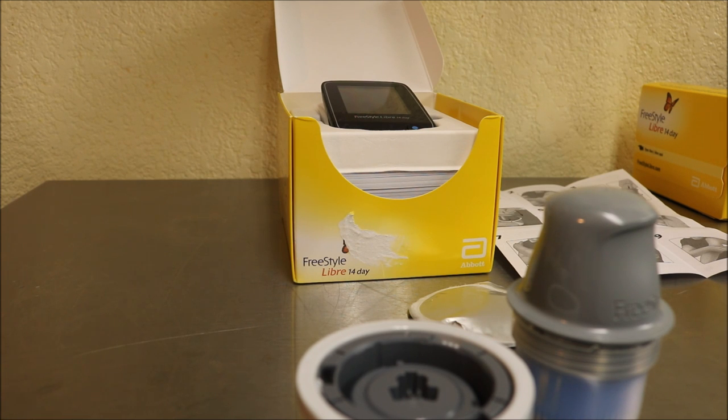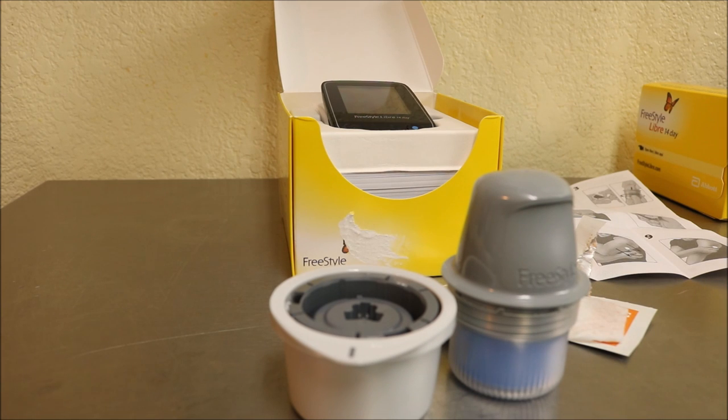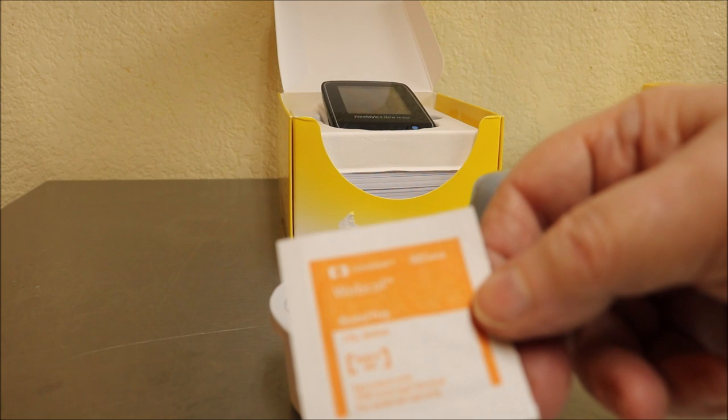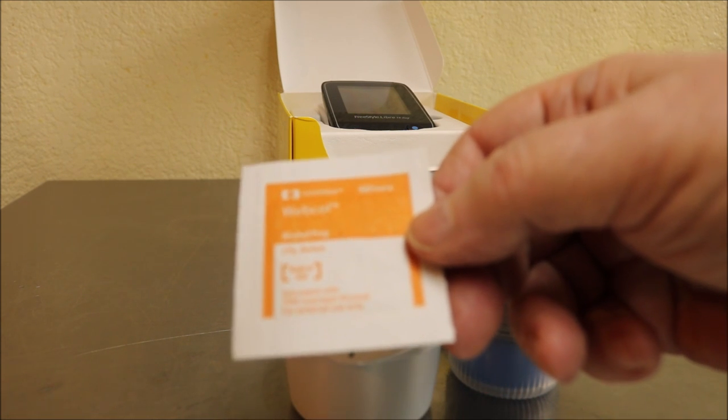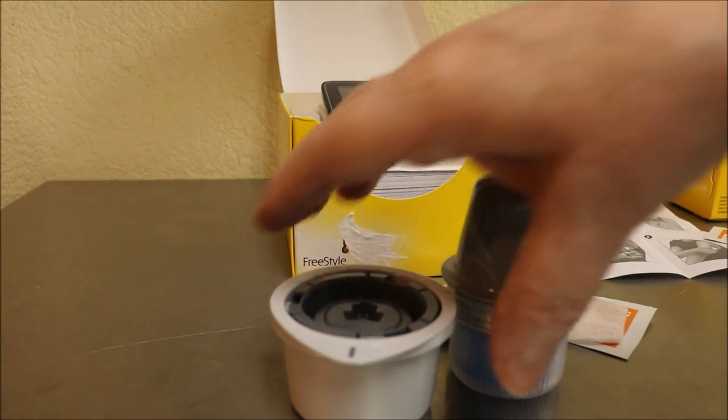Take off my sweater, take one alcohol wipe, give your arm a good scrub, and let the alcohol evaporate — let it be completely dry before applying, since it's going to be on your arm for two weeks. I think the second wipe is to get the residual adhesive off your arm when you remove it, but I have a better way I'll show you later.